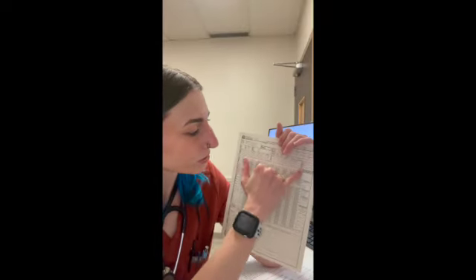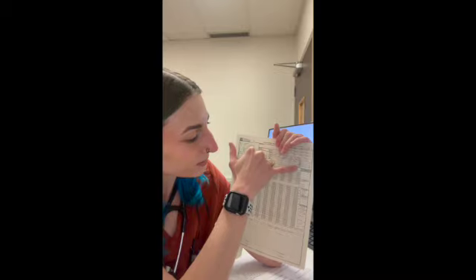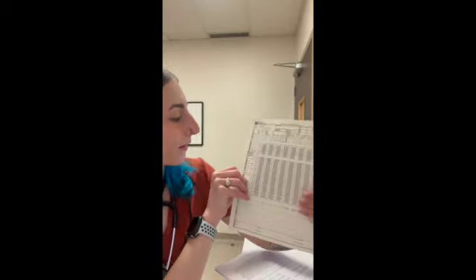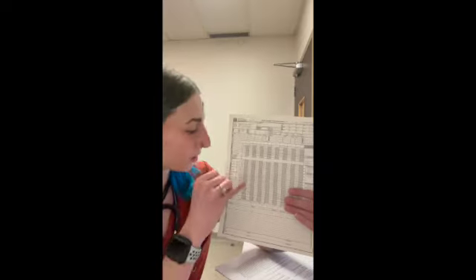And then here on the side, we have our intubation. So it's going to have the size of the tube, where the incisors were located, what time, and whether or not it is cuffed or uncuffed. And then here at the top of our anesthetic record, we are going to have the times, and they're all in 5-minute intervals because we record vitals every 5 minutes on our anesthetic patient.